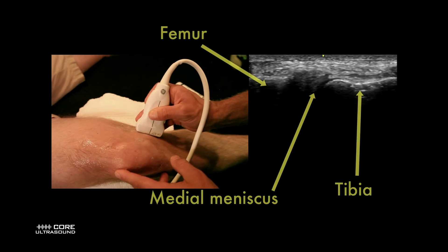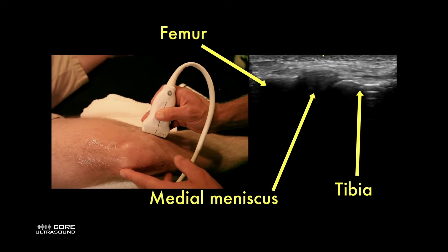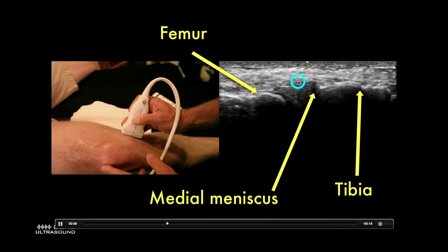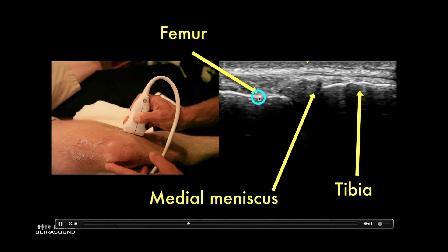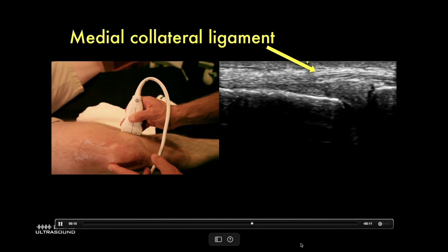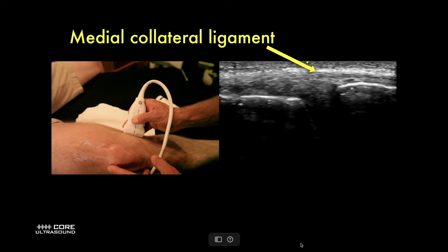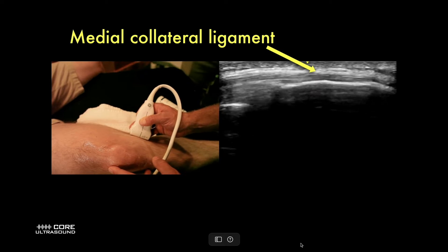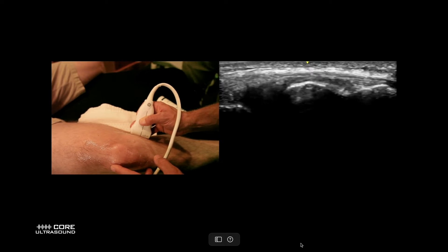Then we can look on the sides. This is the medial aspect — we can see the tibia. We can actually see the medial meniscus; it's that triangular structure right there, with the femur just on the left side. On top of that, we can actually see the medial collateral ligament just over the meniscus. We can see that it is nice and linear — no disruptions in those fibers, meaning no tear.